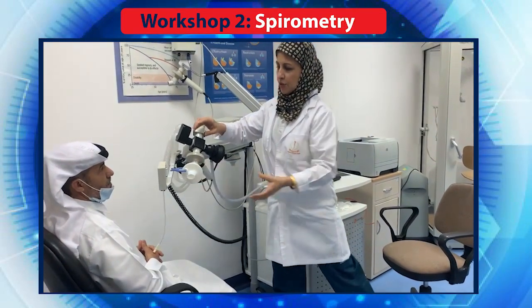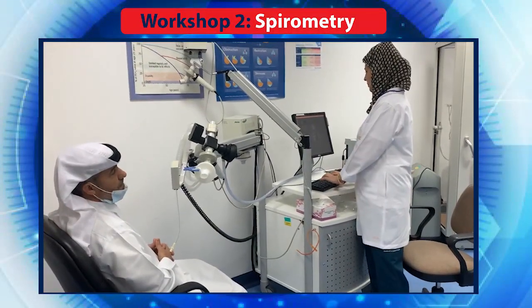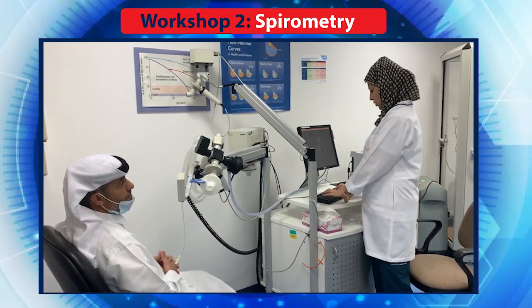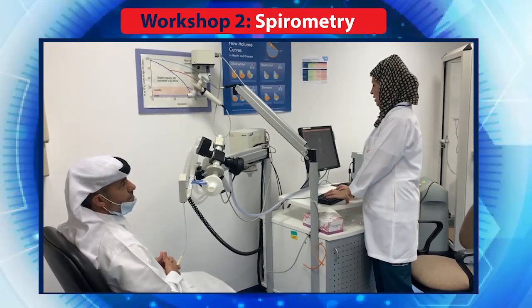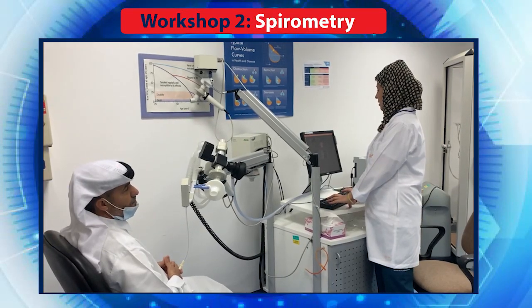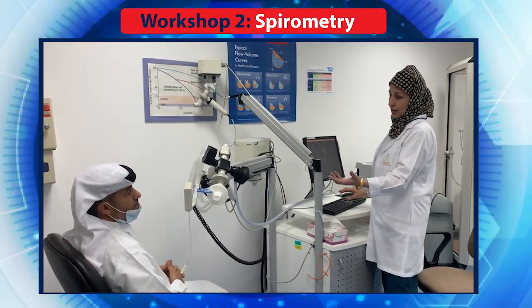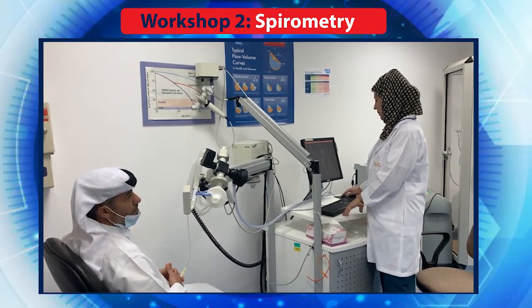Before starting, I'm gonna ask you some questions. Okay. So your name is Abdul Rahim, yes. And your height, 162. 162, and your weight is 64. 64. Okay. So gender, height, and weight is important because with this I can get some normal values for you. We call it predictive values. Okay.